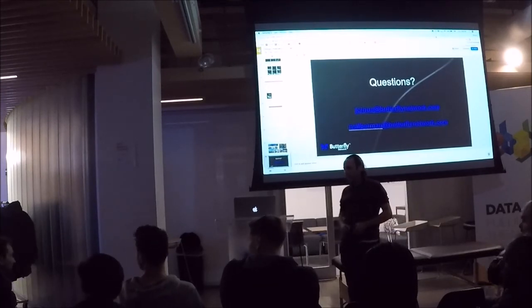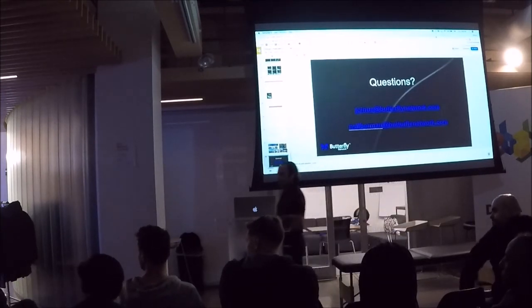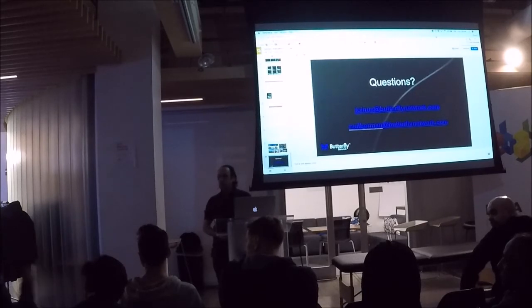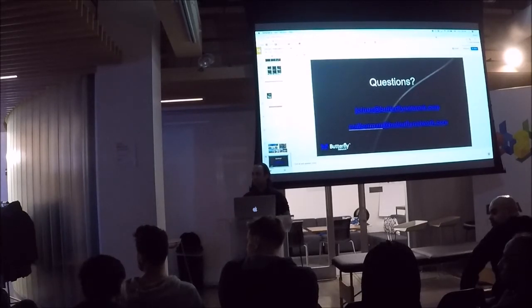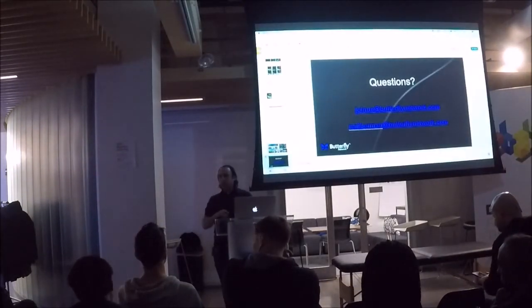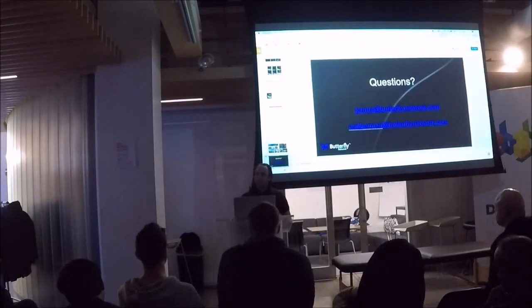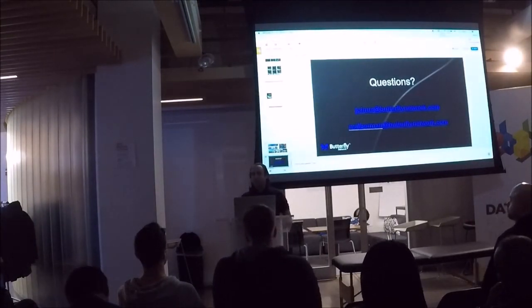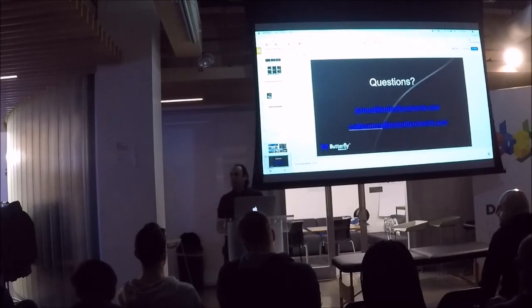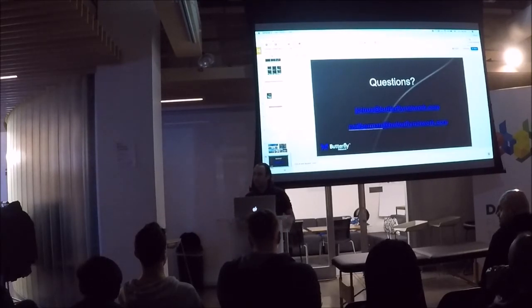I heard the FDA commissioner made a comment that if a doctor reads the image, he's okay with it, meaning that if they use your device and you make the diagnosis as a physician, you're okay with it. Yeah, that's a very good point. Everything that I've shown here is not a diagnosis. It's considered a measurement. So these are indicators which a clinician will use in order to aid a diagnosis or to produce a diagnosis. So those do require different levels of evidence.